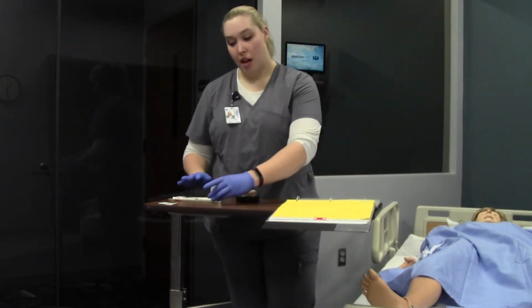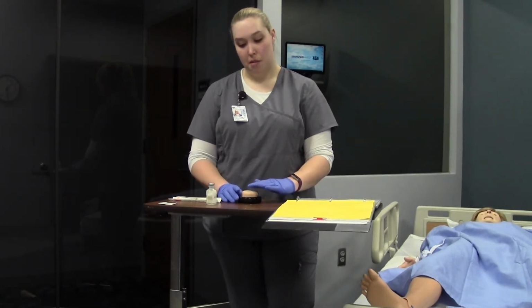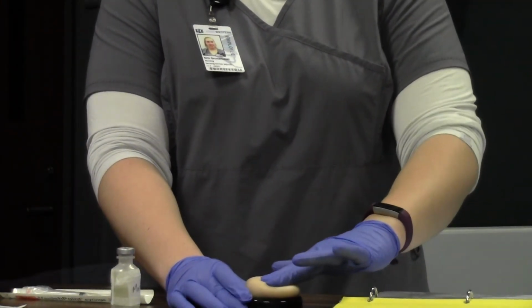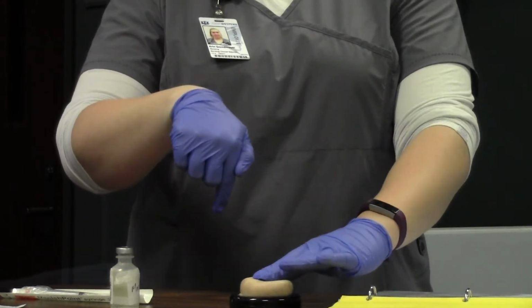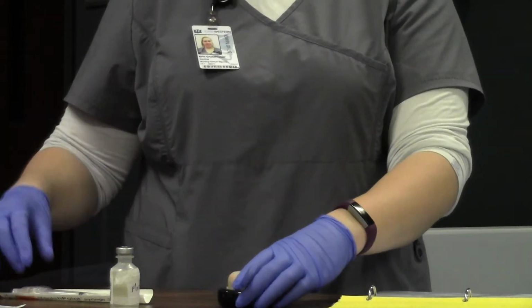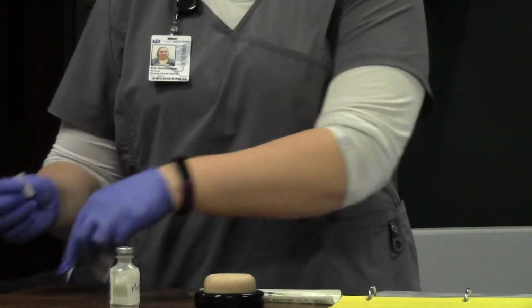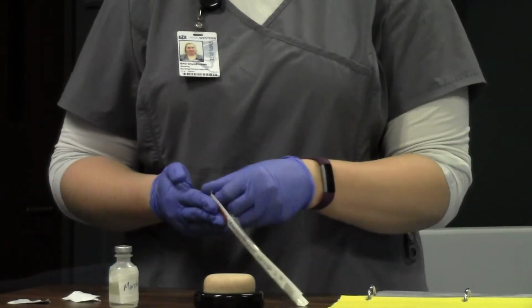When you do IM, you typically may see someone do the Z-track method, which is simply where you're going to pull the tissue over the top of the muscle, inject your syringe, and then give the medication and lock it back in place so that the medication can't come out with the needle. But we're going to go ahead and get everything drawn up first. So I'm going to clean the top of my vial with an alcohol swab, open my syringe.